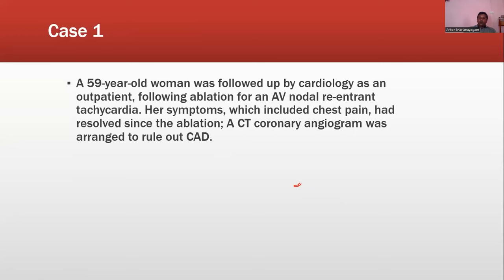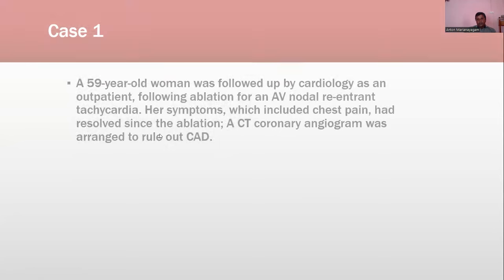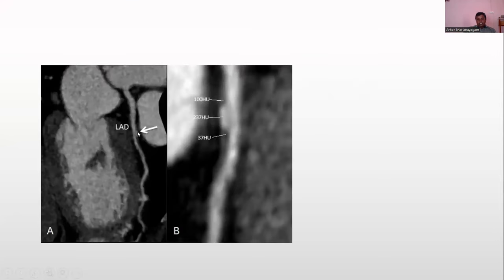A 59-year-old woman was followed up by a cardiologist as an outpatient following ablation of an AV nodal re-entry tachycardia. Her symptoms, which include chest pain, had resolved since ablation. A CT coronary angiogram was arranged to rule out CAD. Now, this is the CT coronary angiogram.